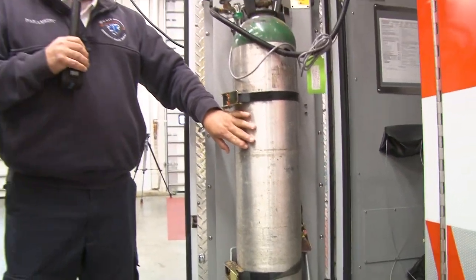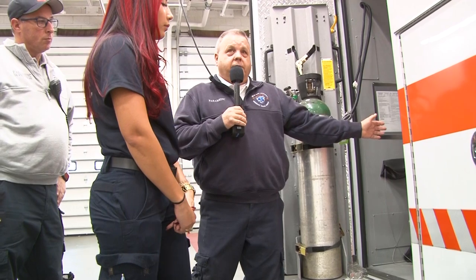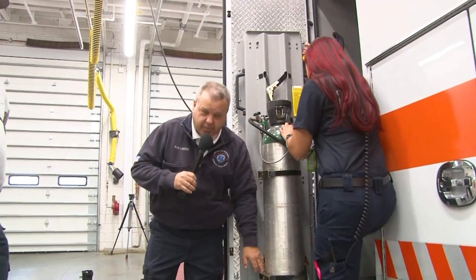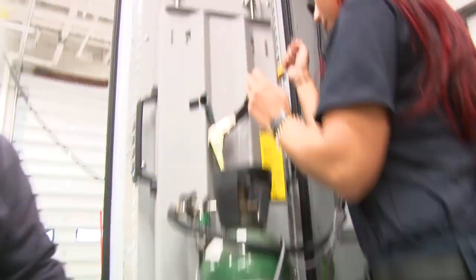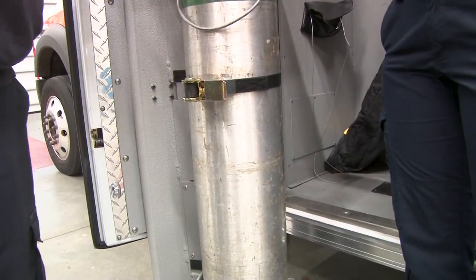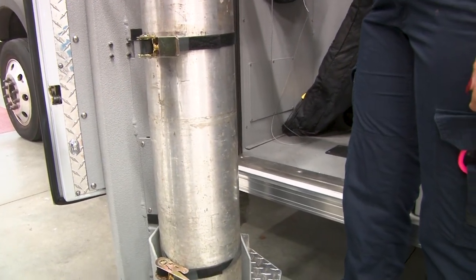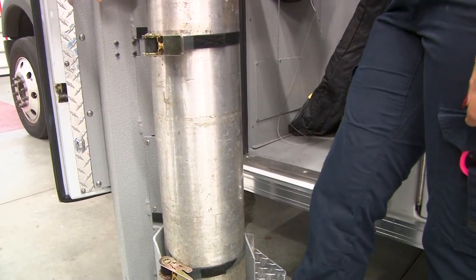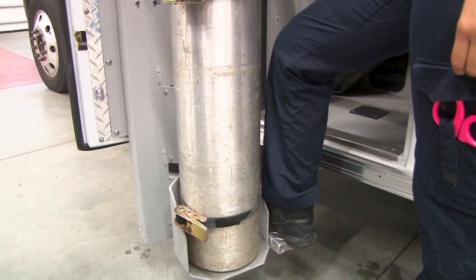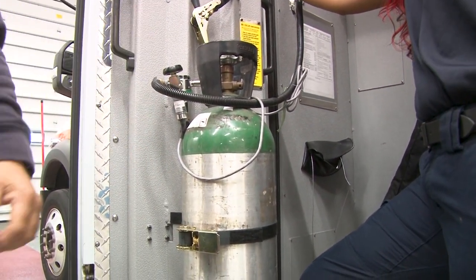So what's nice about this feature is that in the prior ambulances that we used to have, we would have to physically lift this bottle out of this container, and that could lead to injuries. So this ambulance has this device. I can't exactly remember what this device is called, but all she has to do is put a little pressure on it, and it comes right down to the ground. She unbuckles it and rolls the bottle out. So Andrea doesn't have to pick the bottle up and risk hurting her back or any other part of her. So this is a safety device that helps limit any injuries to the paramedics. We change these bottles out just about every other day. So having this device and not having to pick it up certainly prevents injuries.